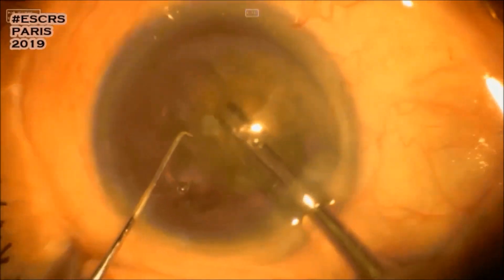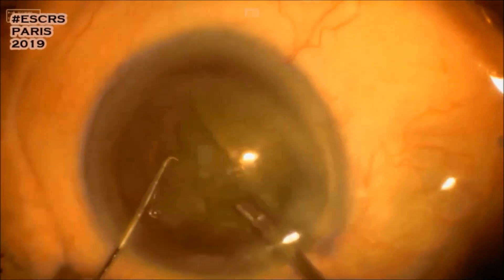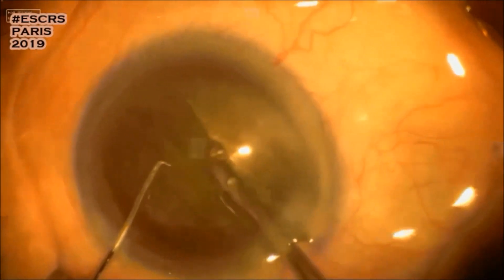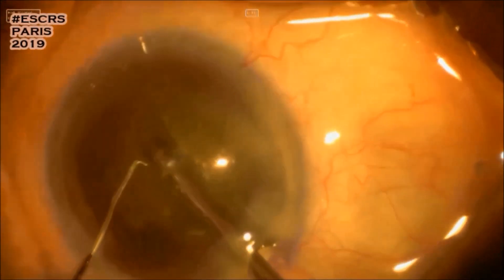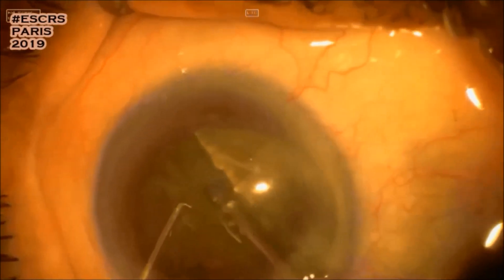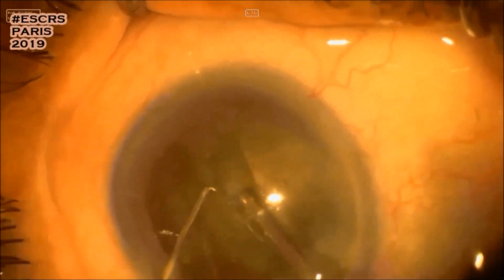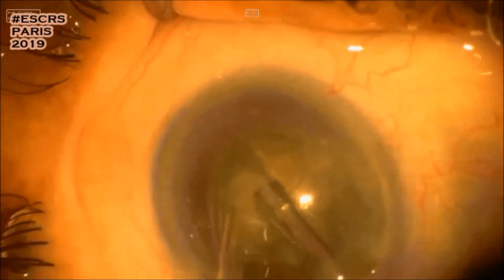After that, the first groove has been made at the midpoint. We decided to do the stop-and-chop technique for this surgery. The groove seems not deep enough to split the lens.